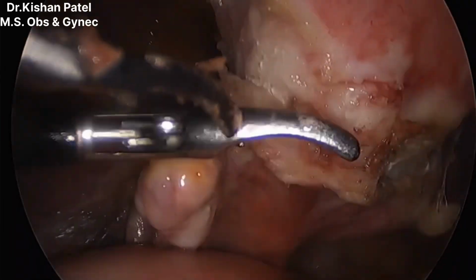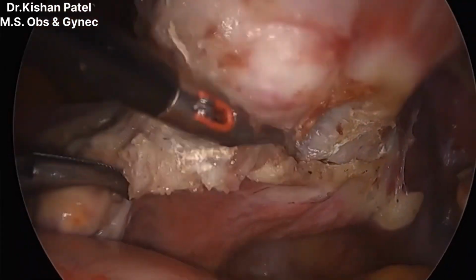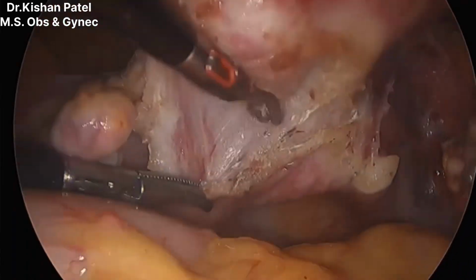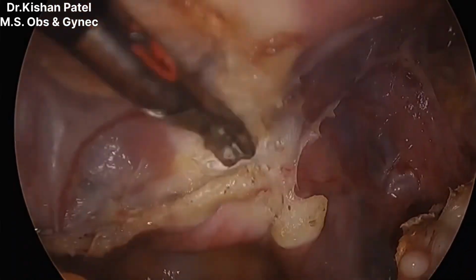As you can see, I am separating the fibroid and going downward to separate the uterosacral ligament and matching the opposite side.